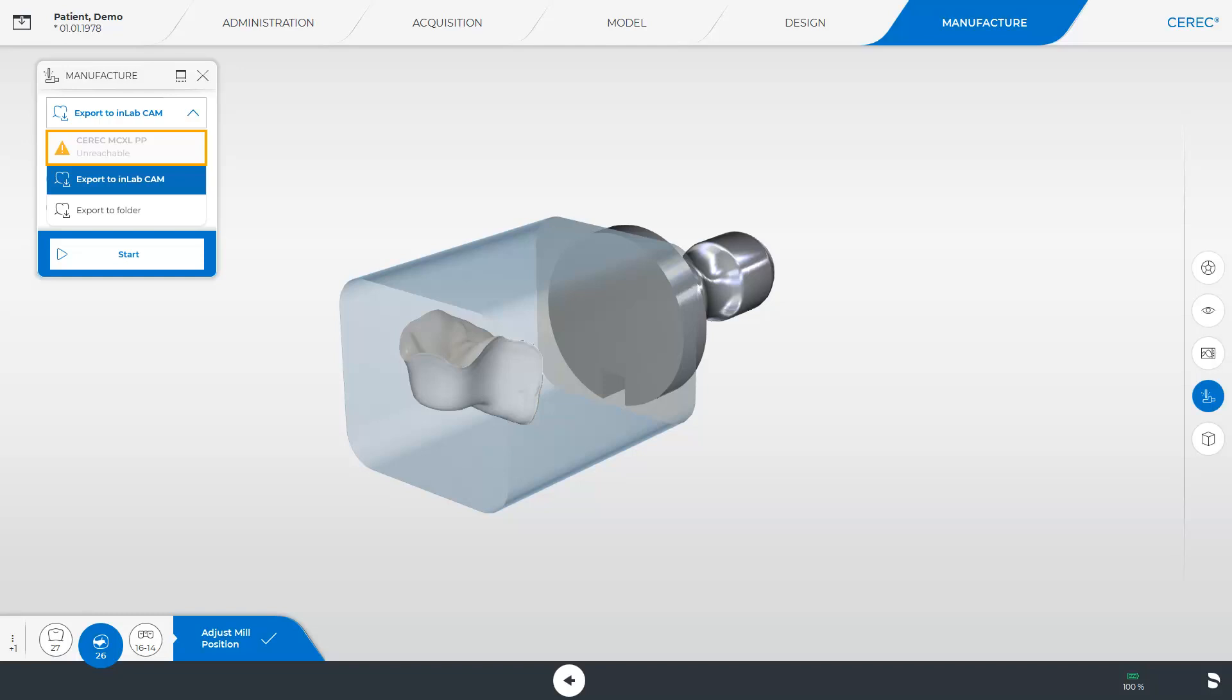Currently, this isn't possible since there is no working connection with the grinding and milling unit. Exporting to InLab CAM makes it possible to export restorations into the object list of InLab CAM. The InLab CAM offers a wider range of functions, such as nesting and stacking, for example. The last option is to export both your model and restoration data into a folder on your CEREC acquisition unit.